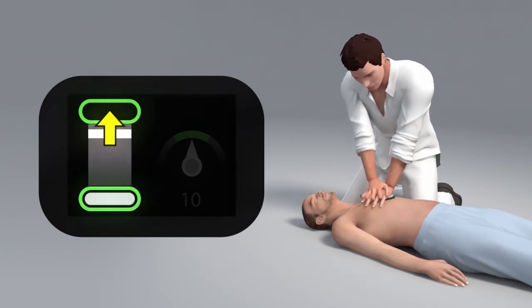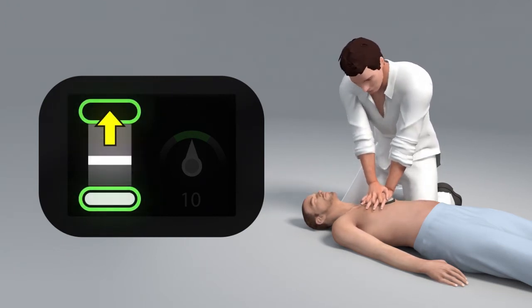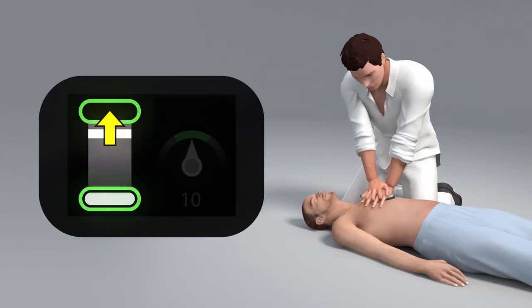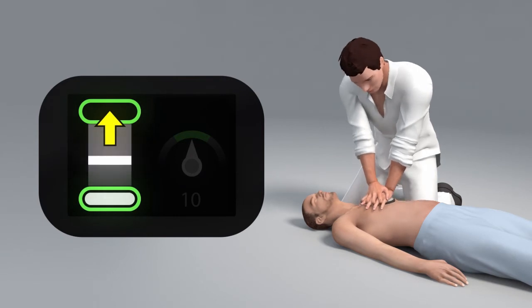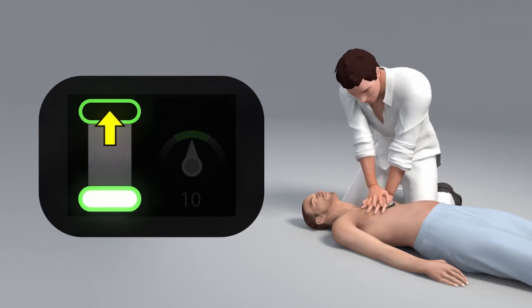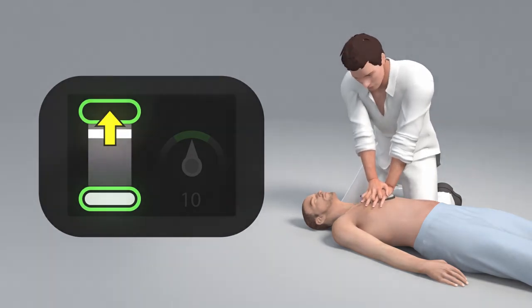If you fail to release continually, you will see a yellow arrow pointing to the release target.